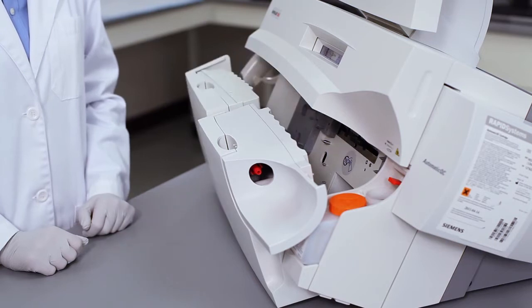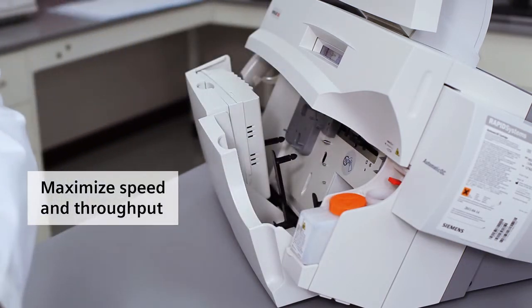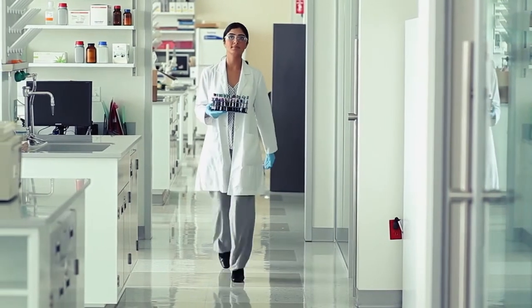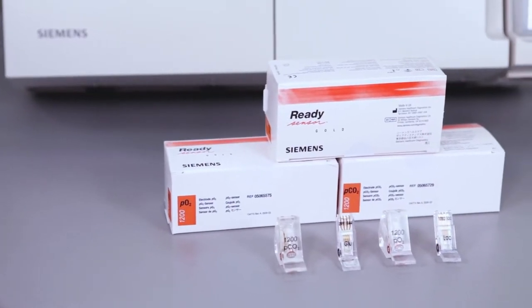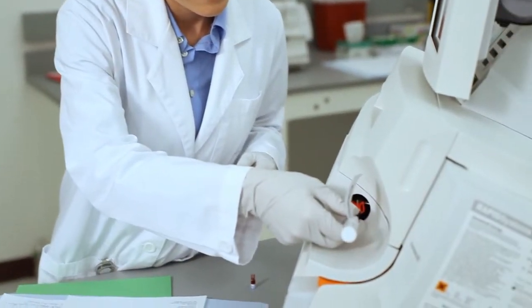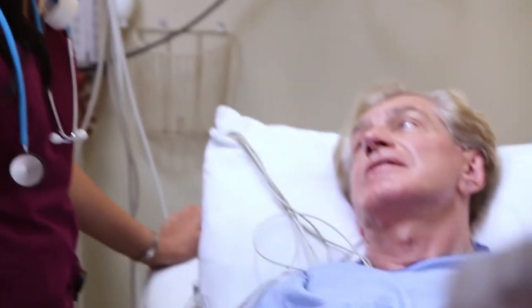The system is easy to use and consistently reliable. Cartridge-based technology optimizes operational performance, especially in medium to high-volume testing sites. With long use-life sensors and fully automated quality control and calibration routines, operators can minimize their time running tests and spend more time treating their patients.